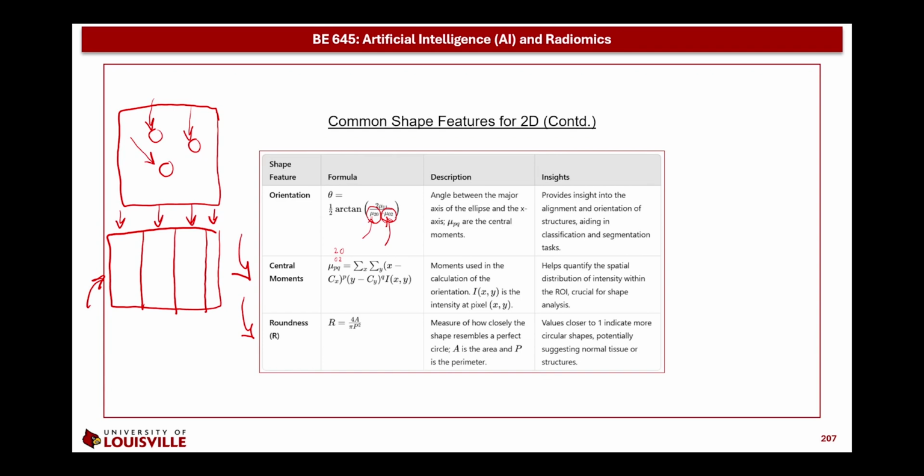And the other approach, which is usual in many applications, is that some images will contain 3 and others contain 4, and the whole dataset will contain varied numbers of ROIs, and in that case you can compute the features for each ROI and then average the results into a single set of features.